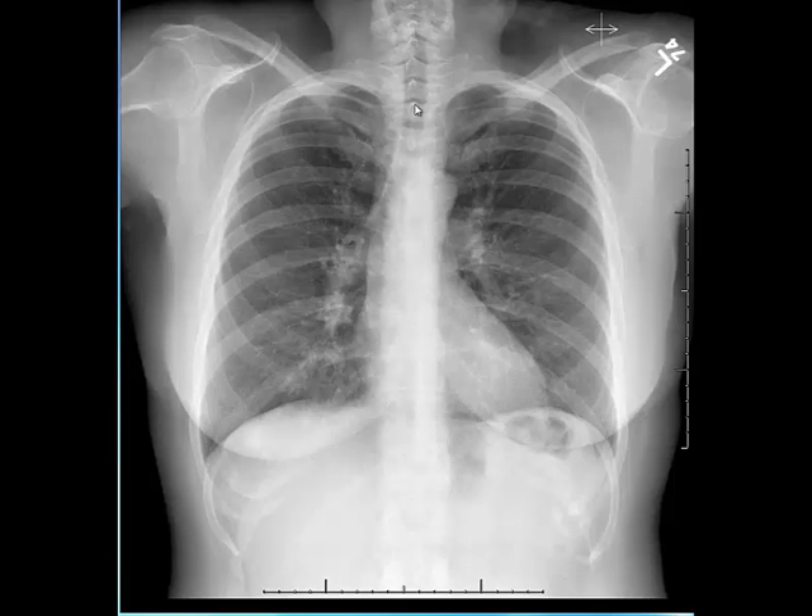The next step I evaluate is the degree of symmetry of the film. For that, we should measure the distance between the medial ends of both clavicles and the spinous process of the upper thoracic vertebra. This distance should be equal on both sides. Here for example it's a little bit smaller on the right than on the left, indicating minimal rightward rotation.